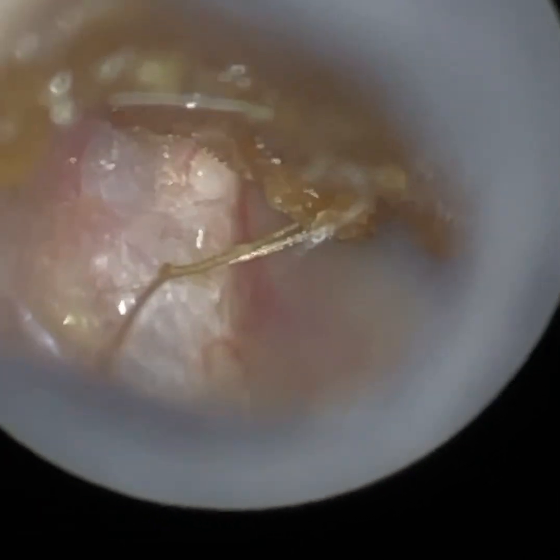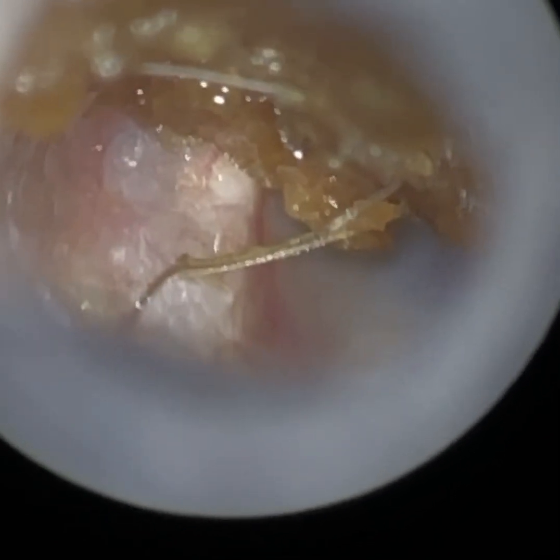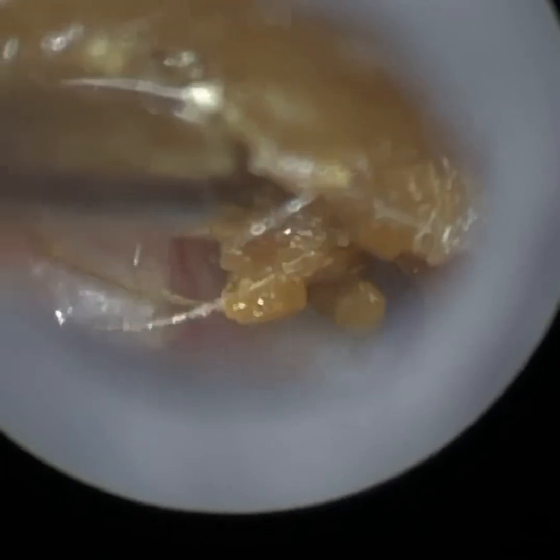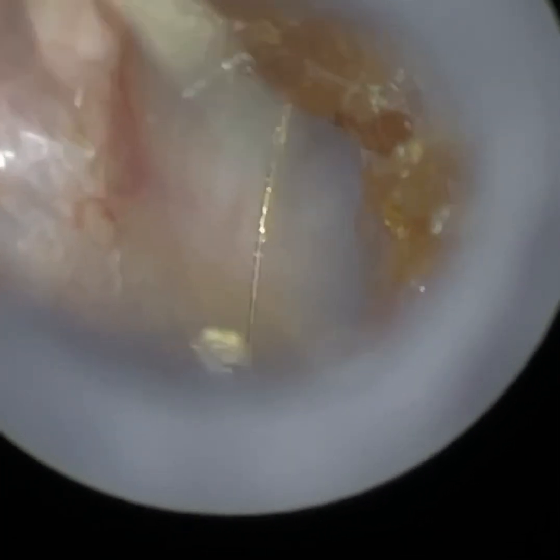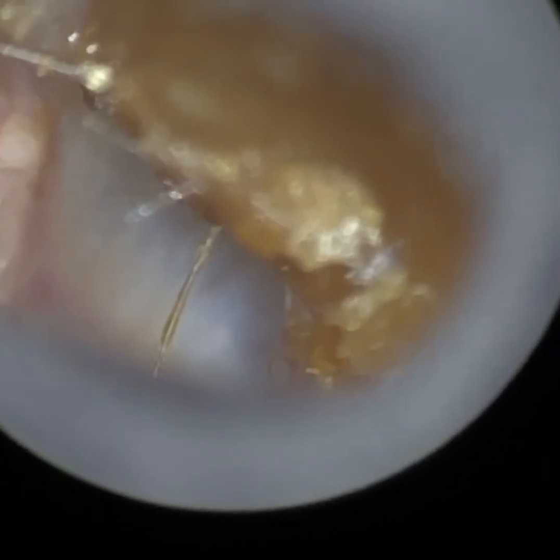So that piece of keratin was on the eardrum itself, and now it's in full view. There's also some wax in the anterior superior quadrant, almost in the anterior recess. Using the fine end and using the Waxscope safely, I'm able to insert the fine end into the ear and remove that from the anterior recess. There's not a chance we'd be able to even visualise the eardrum using loops, never mind removing wax directly off the eardrum.